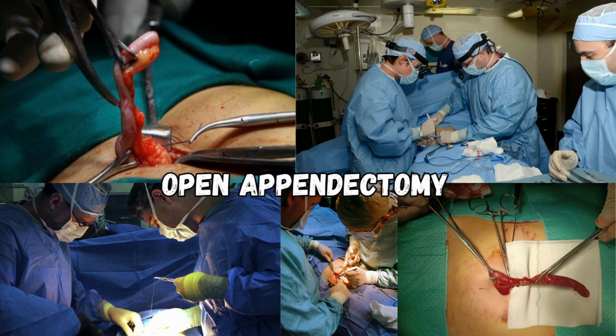Step 6. Dividing the mesoappendix. The mesoappendix contains the appendiceal artery, a branch of the ileocolic artery. Using curved Kelly clamps or tonsil clamps, small segments of mesoappendix are clamped, divided, and ligated with 2/0 or 3/0 silk ties. Alternatively, the entire mesoappendix can be divided using electrocautery and ligated en bloc, depending on the surgeon's preference. A common pitfall at this step is inadequate control of the artery, which can result in bleeding.